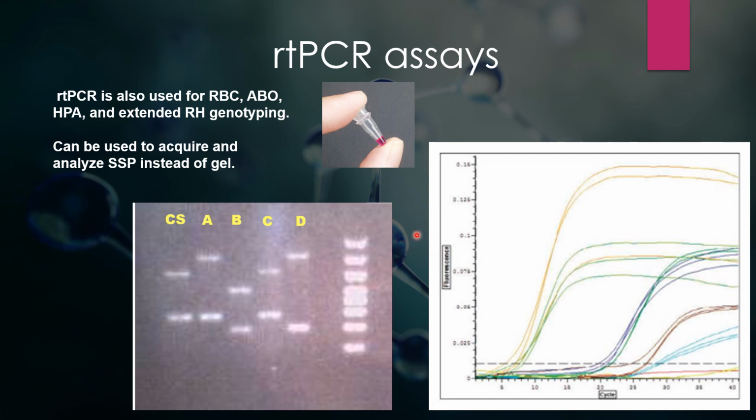This can also be visualized if you gel that plate. Each well you could visualize this way. So one of these is A, we'll call A, B, C, D, and you have an expectation of where that SNP would be. Usually we would only see either it's there or it's not. And then each well also has an internal control.